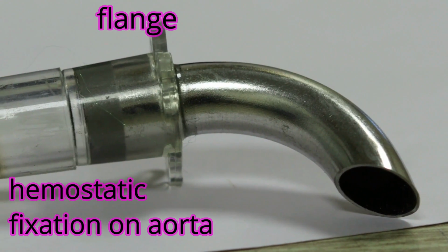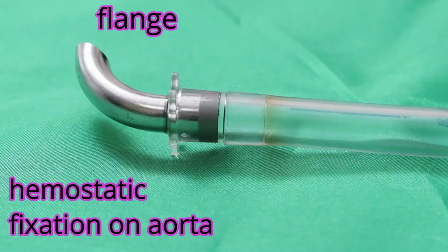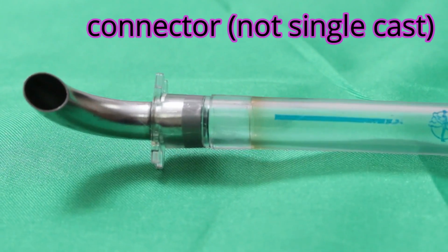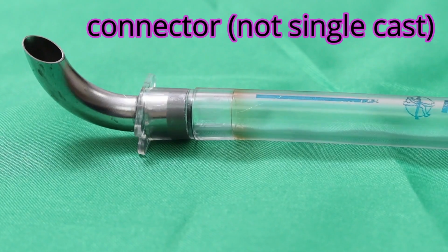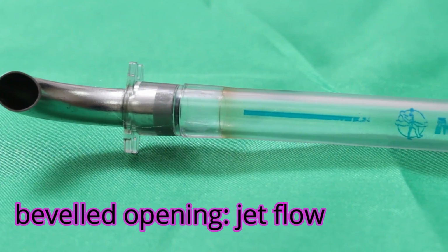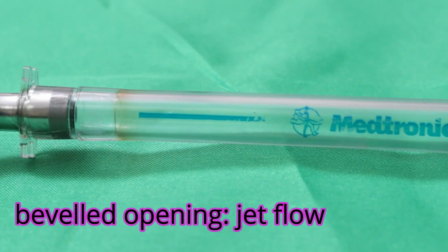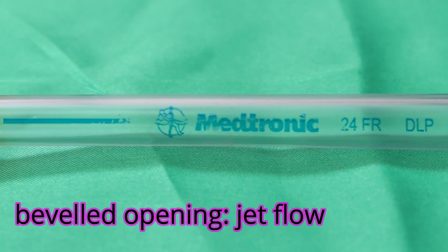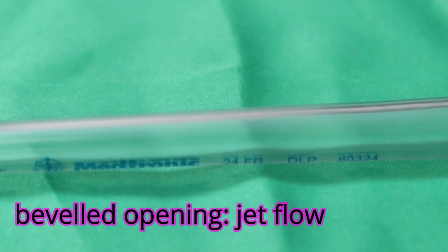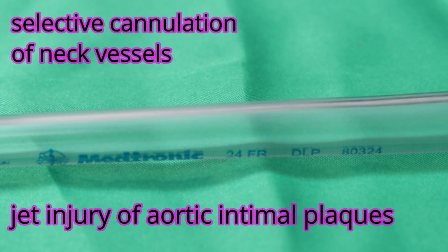It allows you to fix the cannula to the aorta and also stops the cannula from entering too much into the ascending aorta. Mind you, this cannula is meant only to be used on the ascending aorta. It is a beveled opening, so therefore it tends to give a jet flow. Whenever there is a jet flow, what happens is the jet can either hit the posterior wall of the arch or the ascending aorta and give rise to a shower of arterial emboli.